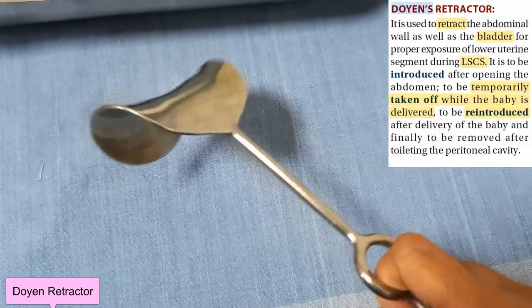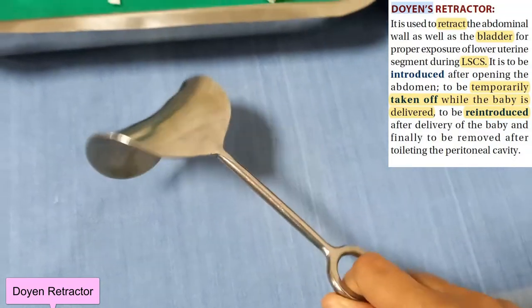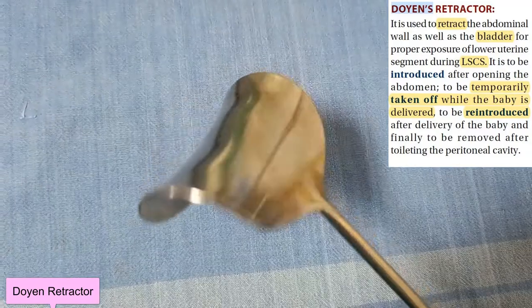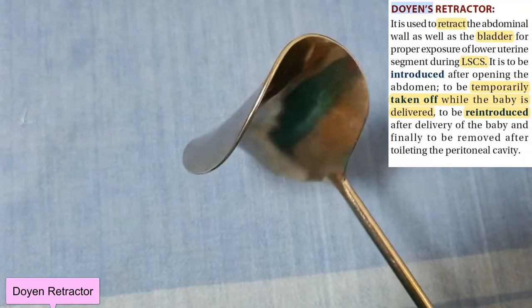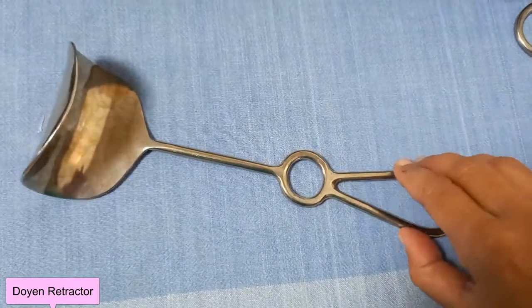Doyen retractor: flat curve with concavity inside on one end and handle on the other end. Use it for abdominal and pelvic surgeries to retract the abdominal wall and bladder, like in cesarean section.